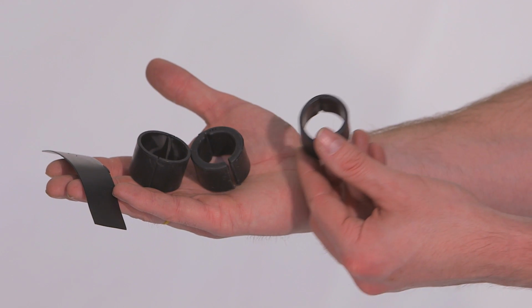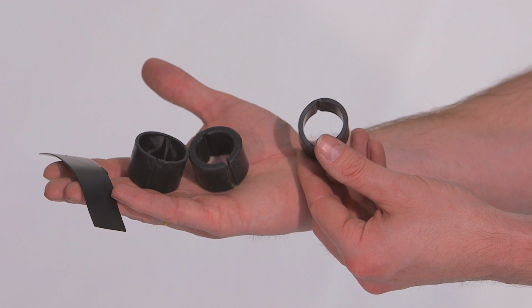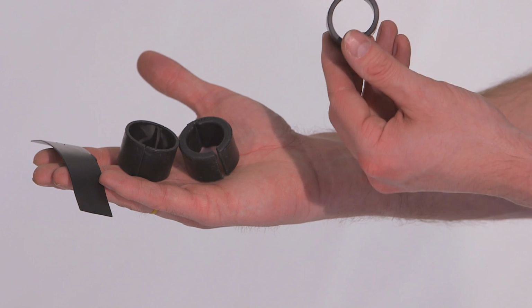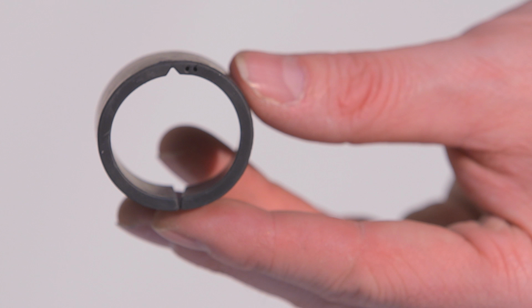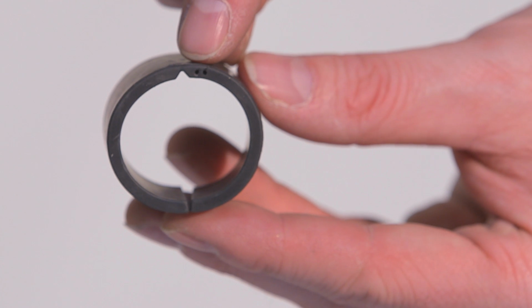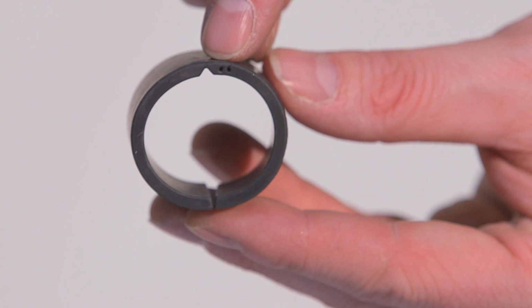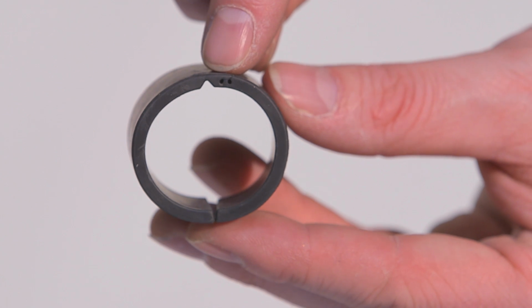You'll also notice a number of rubber inserts provided with your clamps. These correspond to the exact axle diameter of the chair and also give the clamp some grip to prevent it from moving or rotating during use. If you look at the sides of these inserts, you'll see a number of dots. A majority of the time, you will use the 1 or 2 dots, but refer to the chart in the axle clamp mounting instructions for which rubber insert corresponds to which axle diameter.